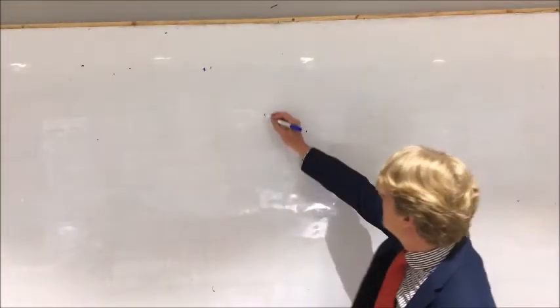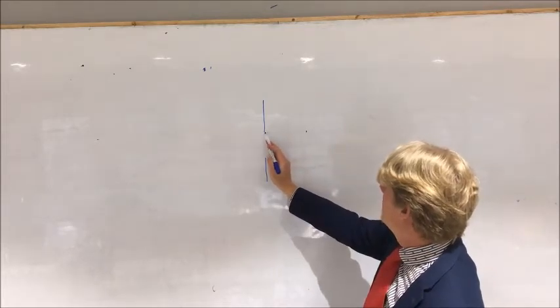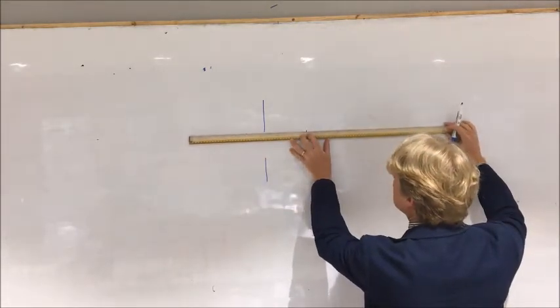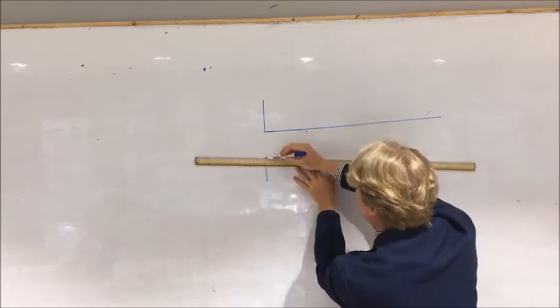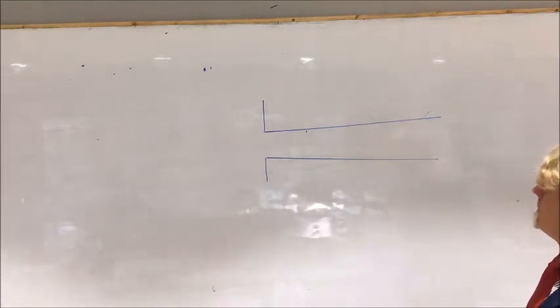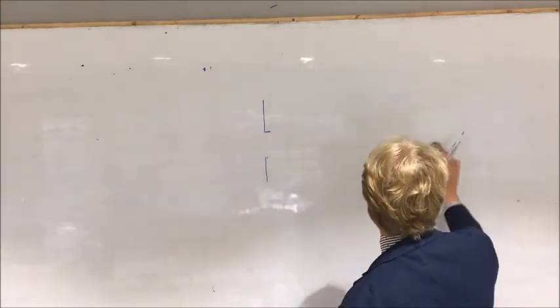So first of all, we just want to remind ourselves that when you've got rays coming out of a gap like this, even very, very high frequency ones, we eventually get spreading of the rays as the distance goes on, like this. So as it comes through the window, it's spreading out. I'm exaggerating it a little bit. It's getting wider, like that. Okay, that always happens. So one thing that we can do first of all to avoid that being quite as much is to make that hole smaller. So if the hole is smaller, then the ray is going to be thinner. Now we'll talk about why that's important in a moment.